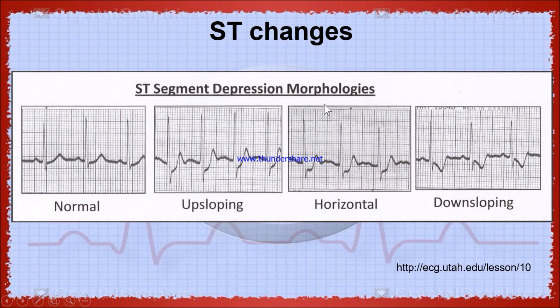Now let's see the ST segment depression morphologies. This is a normal ECG. This is upsloping ST segment depression. We can see here this is upslope. This is horizontal ST segment depression, and this is downslope depression.